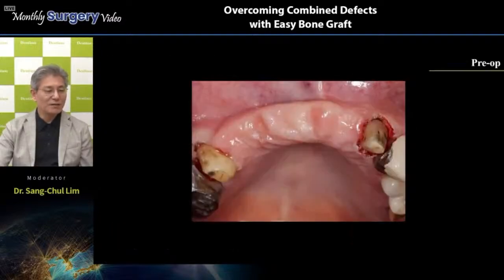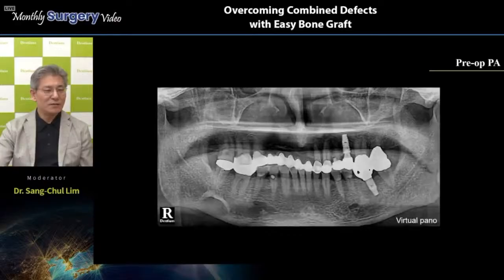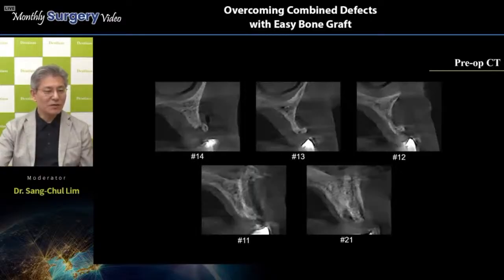Pre-op view is here. And panoramic view, long span upper anterior area. As I mentioned before, the narrowed ridge. Let's see number 13, 12, 11 area. Extremely thin ridges here, so it is impossible to get the proper diameter implantation in the proper location, right? So I think we need the GBR, a big GBR procedure, or skip implantation on this area.